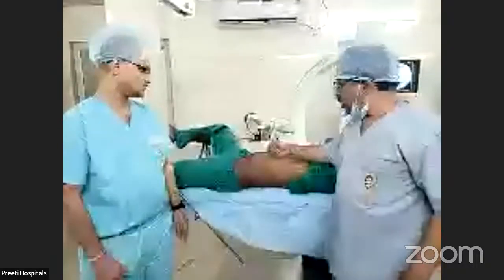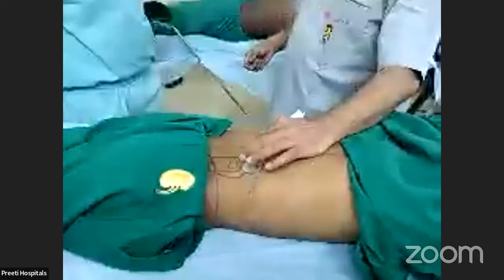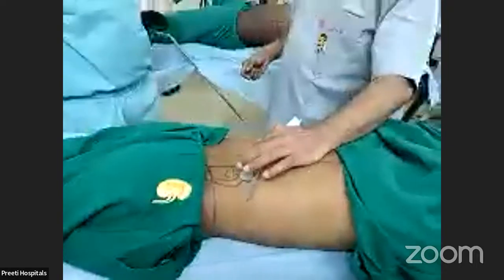You remove this stone, you remove that stone easily. Whereas here, by chance, if you go to the middle calyx, suddenly you may not be able to go to the pelvis. But most of the time it is good for supine, except for the anterior calyx, which may not be easy.